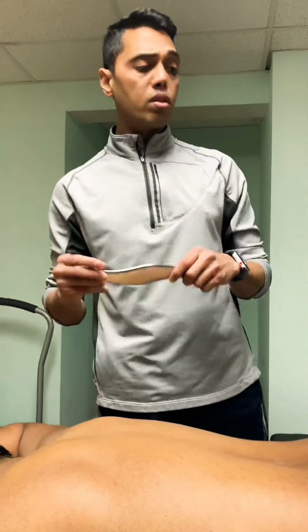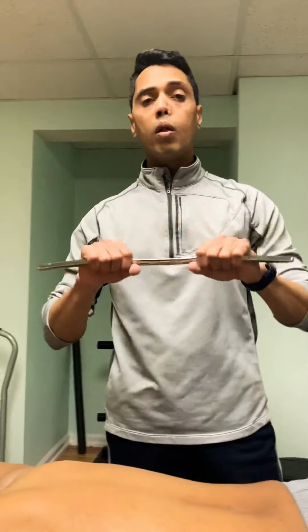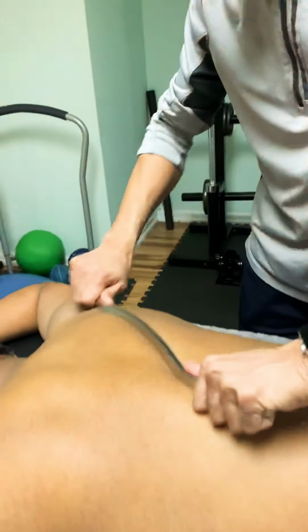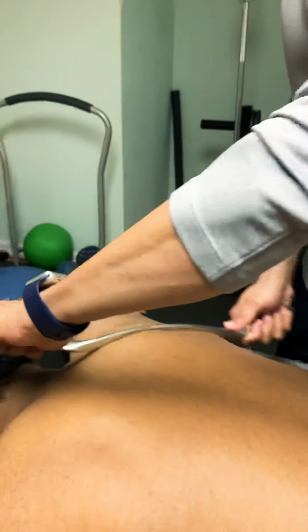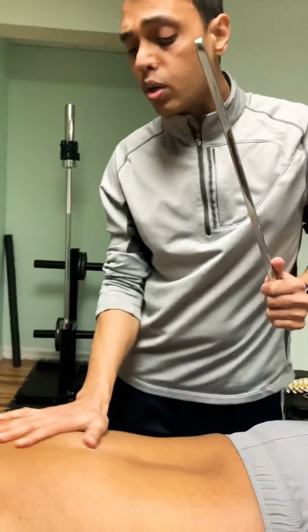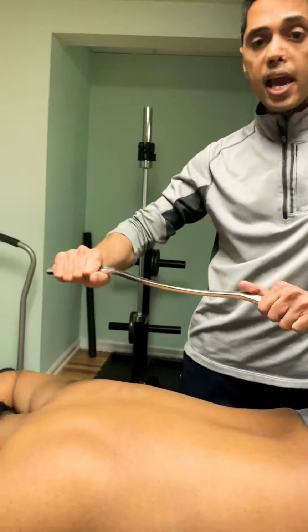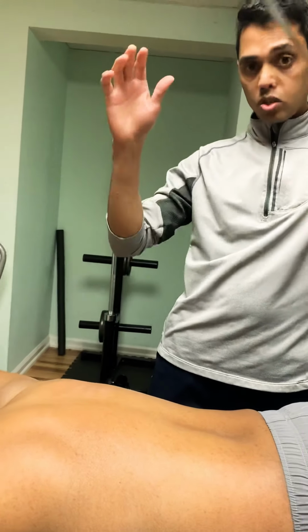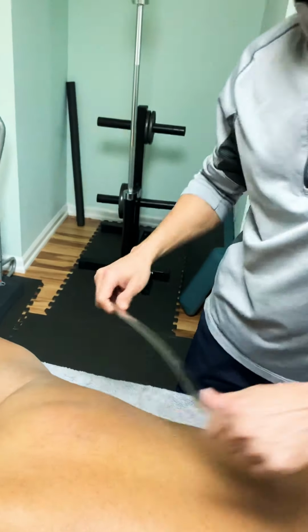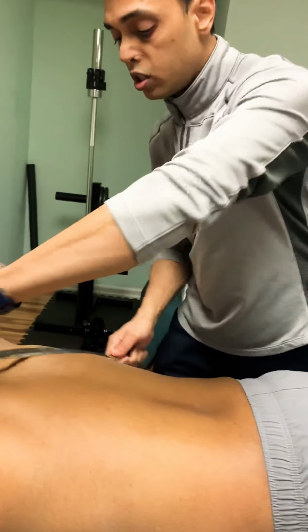But if I want to use larger areas to cover for mobility, I would use my long bar, the mobility bar, on the area so I can really dig into the tissues and go in different directions. Well, guys, I could use my hand to do this, but I wouldn't have good support, nor would I be able to pull like this. I can't catch. That could cause pain to the patient. So this is a very good tool to use. You just have to know how to use it, which we will be doing in our subsequent videos. But I want you to know that I could use different strokes.